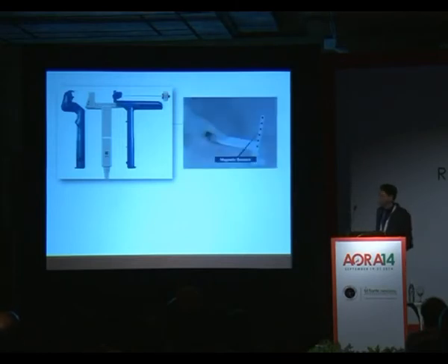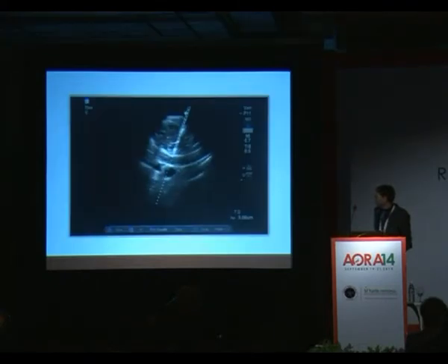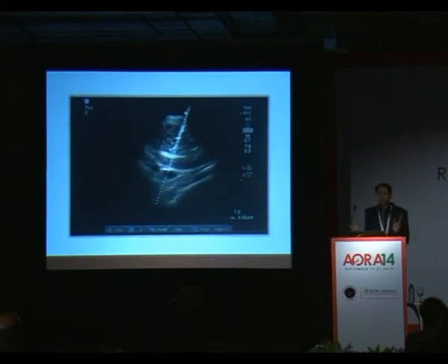Now the probe also has magnetic sensors on the side. So when you advance in, you can see that the data is interpolated onto the ultrasound image, a very similar concept to what you saw with the GPS system. This is how it works. And this is an image of the video of the subclavian being cannulated. So you can see it's very easy to aim and shoot.